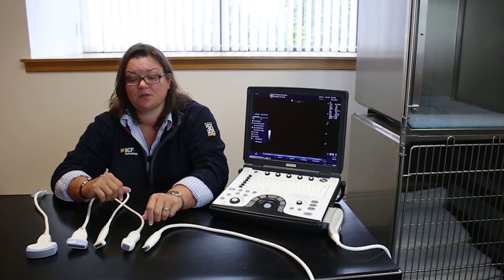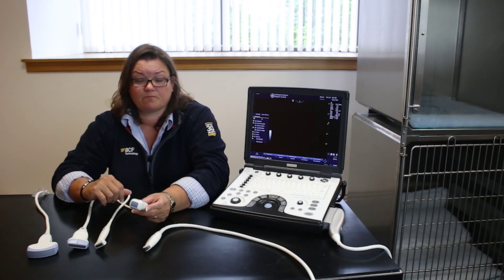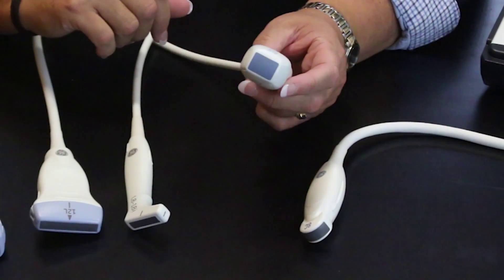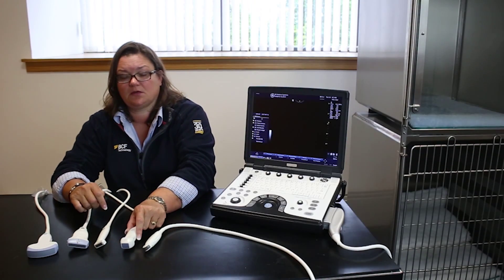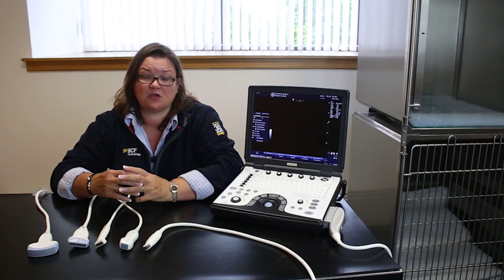If you want to do cardiology, the 6s phased array probe is the best suited probe. You can see it has a square head and will allow you to get the faster frame rates that you need in cardiology.